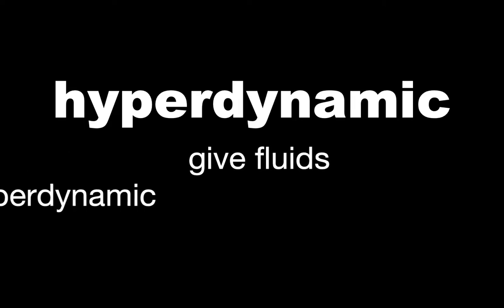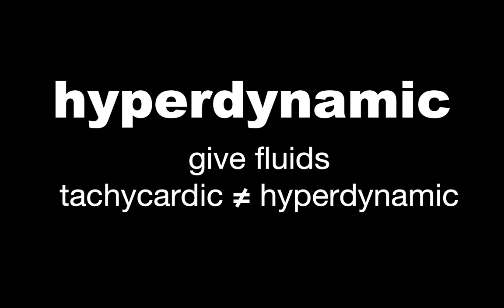So in hyperdynamic states, these are patients that obviously need fluids. One other PSA is tachycardia does not always equate to a hyperdynamic state. You can have a hyperdynamic state with a normal heart rate and vice versa. Next, we'll talk about pericardial effusions.